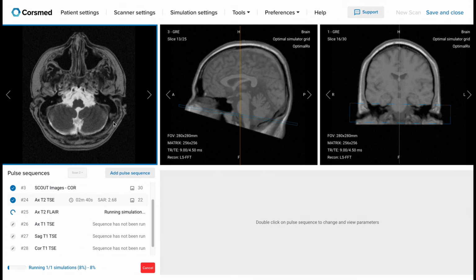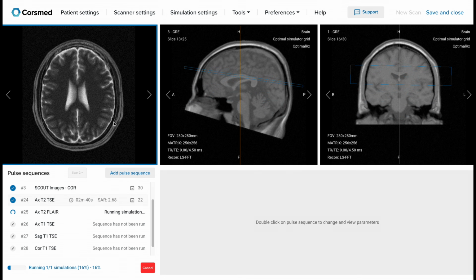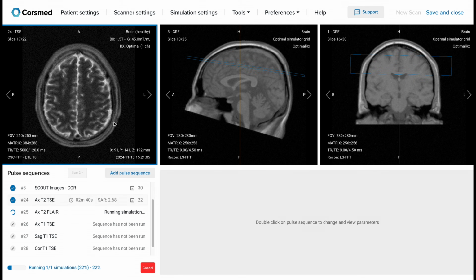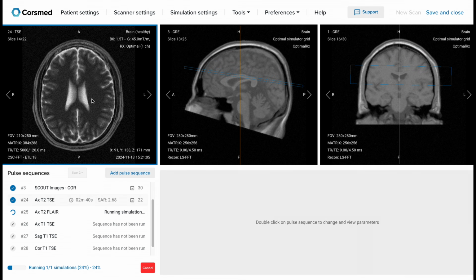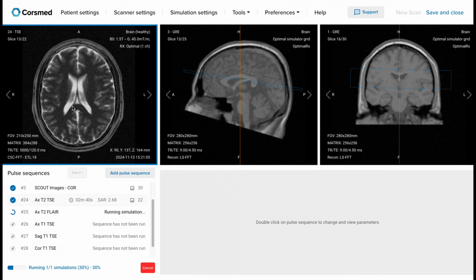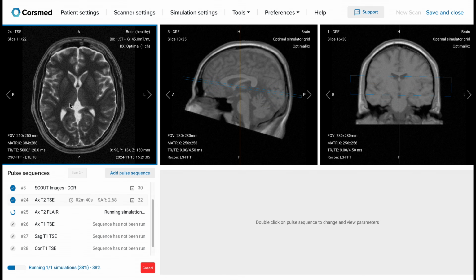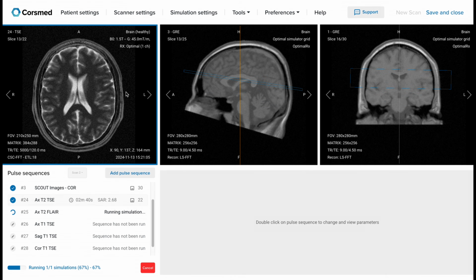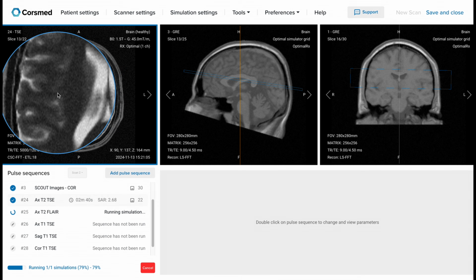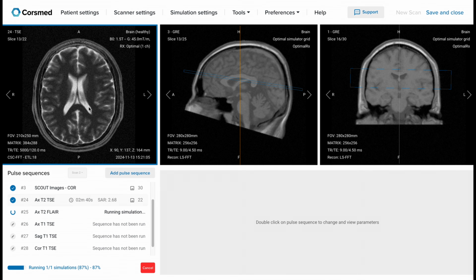In the meantime, we can check our output image. And as you can see here, our image is correctly displaying the anatomy. We can scroll through the slices, and on each side of the brain, we can see that the structures appear and disappear together. In a healthy brain, the structures are usually symmetrical. That symmetry helps you know if the scan is good. If the right and left sides don't match, like if the ventricles don't show up at the same time, you might need to run the scan again to fix it.